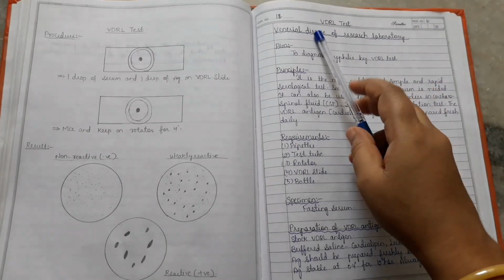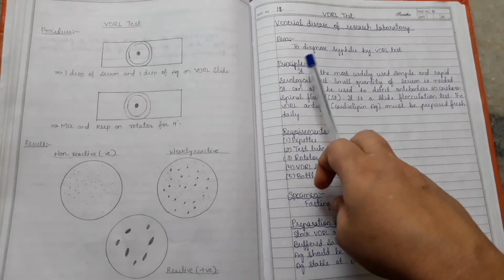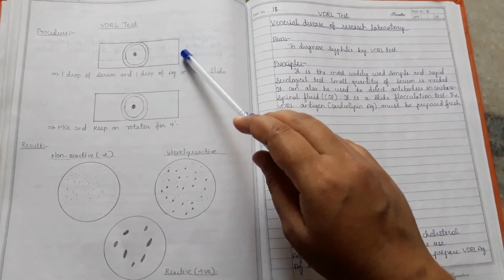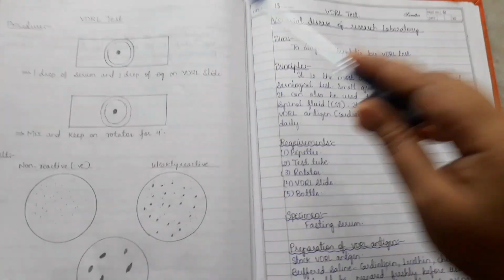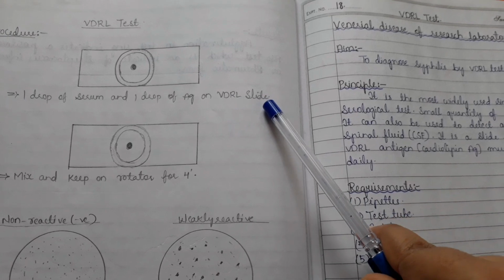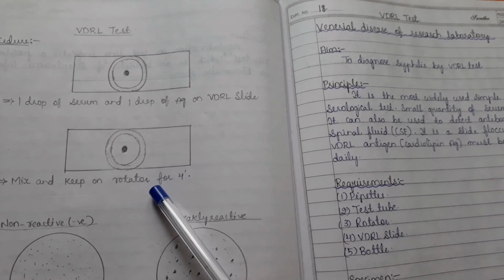The 18th one is VDRL, Venereal Disease Research Laboratory, to diagnose syphilis. One drop of serum plus 1 drop of antigen on the VDRL slide. Mix and keep on a rotator for 4 minutes.